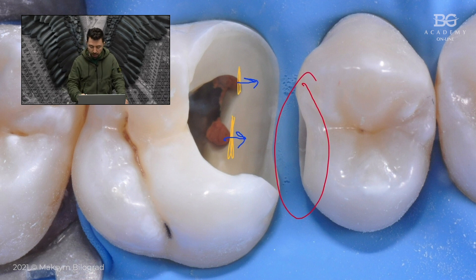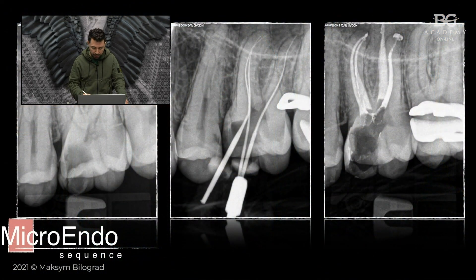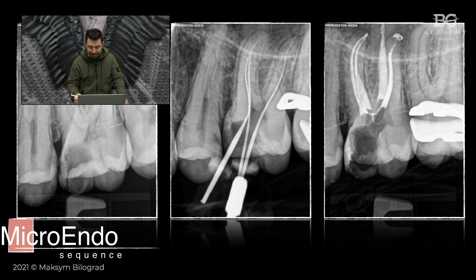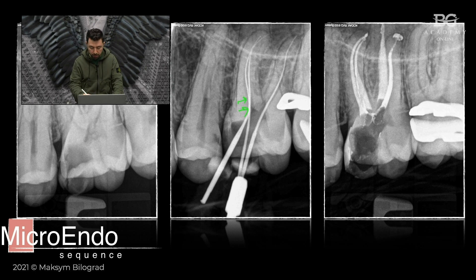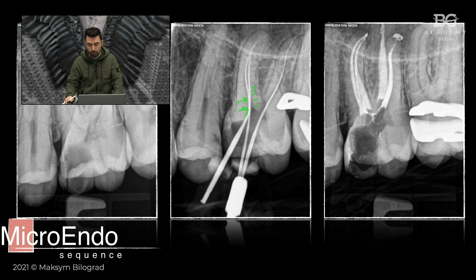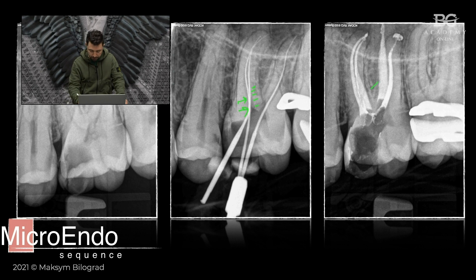You can see it on the next slide. I would like to point out that my files are not in a straight position during insertion. That leads to a situation where, when you have resistance from the mesial aspect, the file will deflect toward the minor curvature and cause over-instrumentation on that minor curvature, as you can see here.